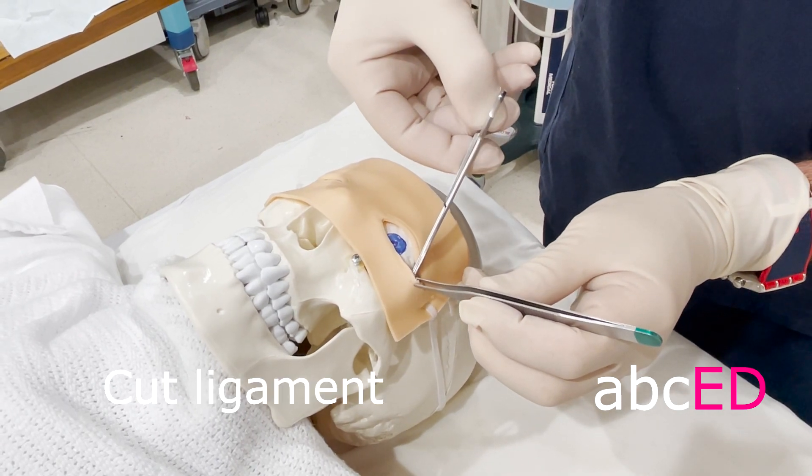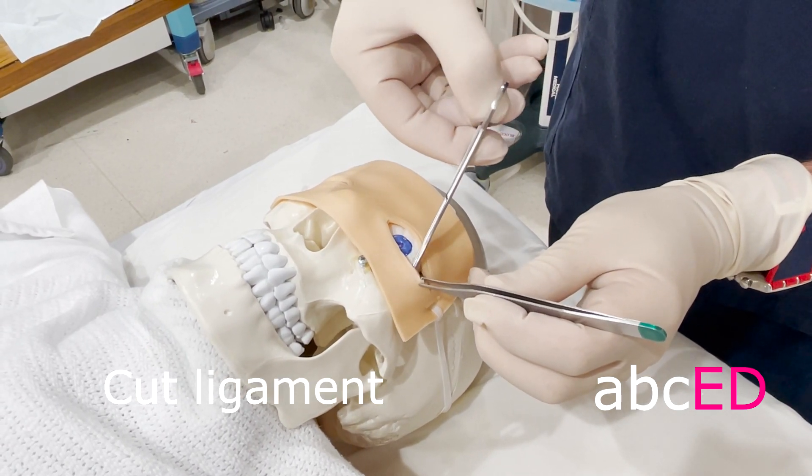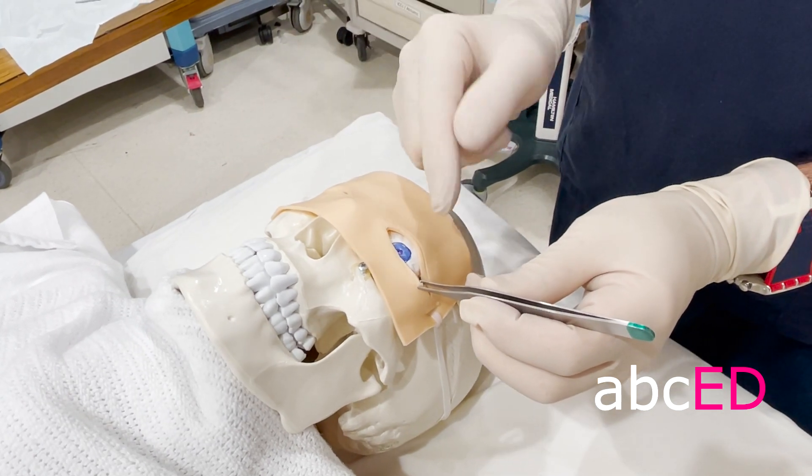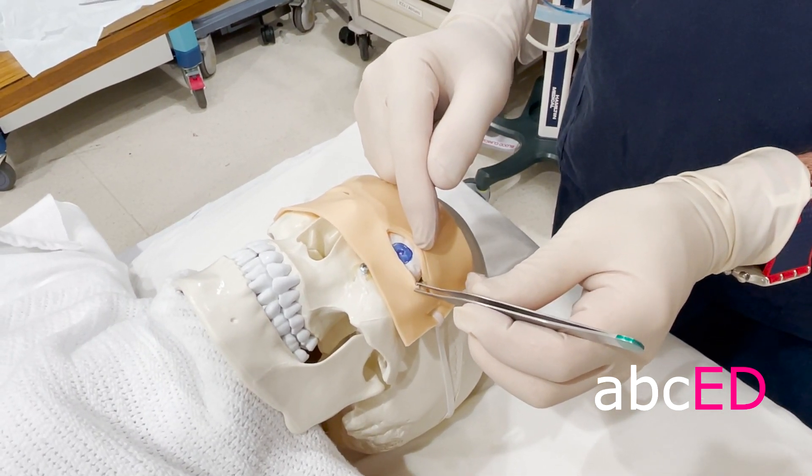And I'm going to cut. That feels like I've cut and I've got a release. In a real patient you'll often actually see the eye just bulge forward a little bit and give.